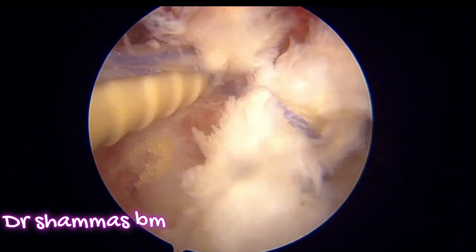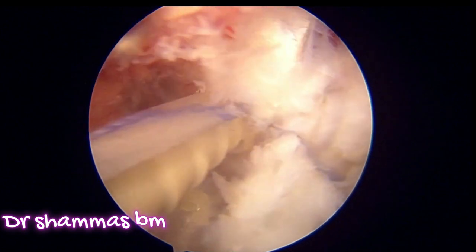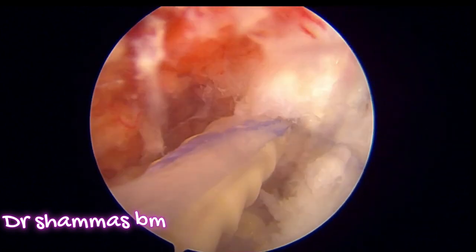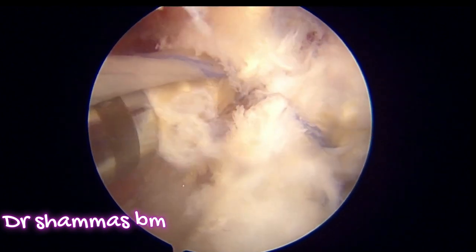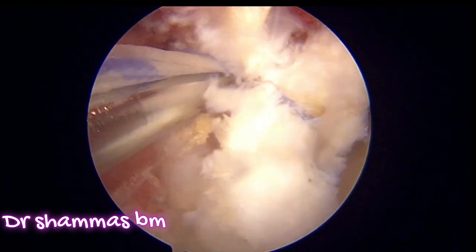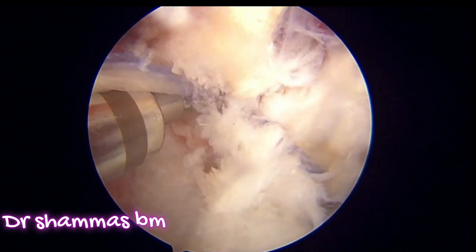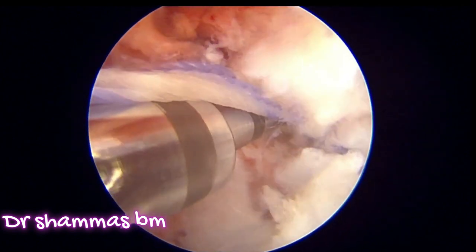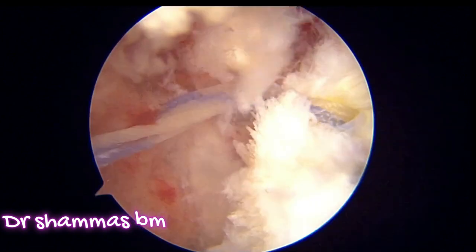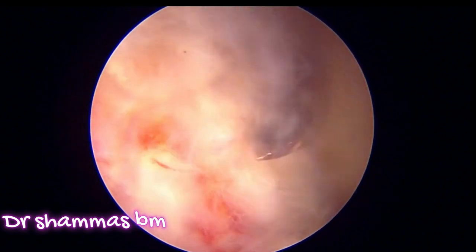The peak nautilus anchor has come in. You tap, tap, tap and it goes inside — along with that the labrum is getting tight. Once you get a good hold, you stop and remove the instrument. Check whether the labrum is reasonably fitting and tight. Then use a suture cutter to remove the extra suture material. Now you can see that the first suture is in place and the labrum is getting anchored.